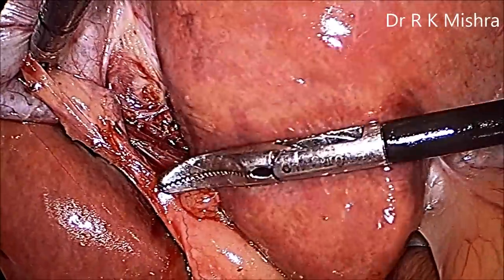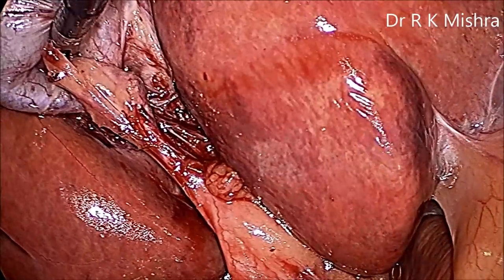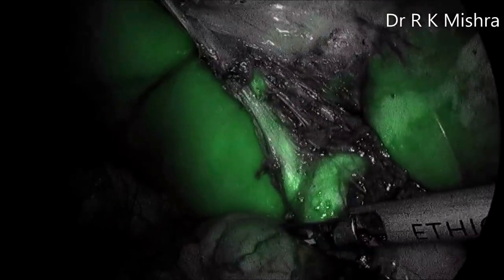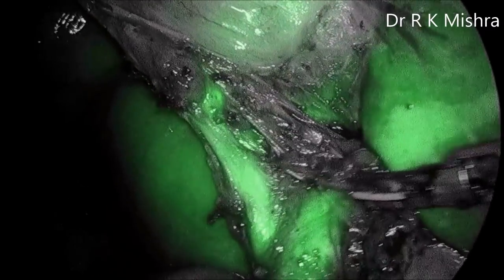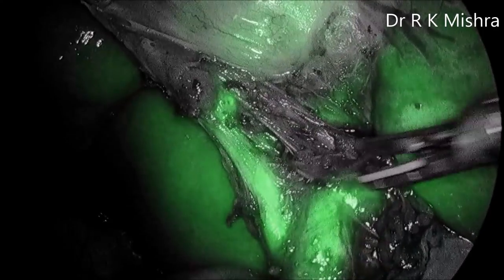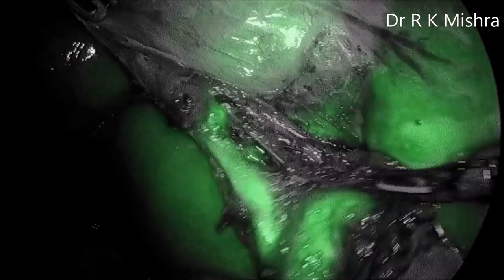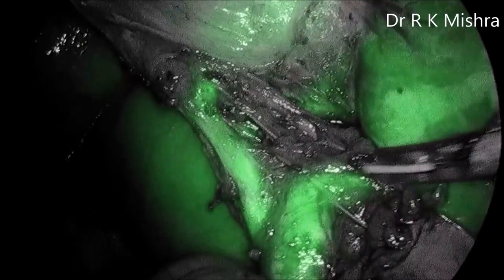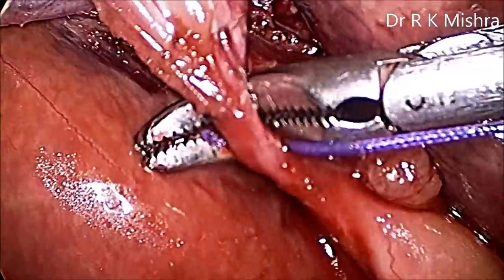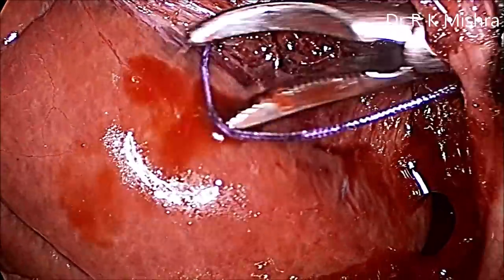Now we will switch the ICG on. There is a button on the Stryker 1588 camera and once you switch it on, you can see the cystic duct, CBD, and common hepatic duct very nicely. The ICG mode is the IRIS mode on the Stryker 1588 camera and it has a special light source, so it will clearly show you the common hepatic duct.